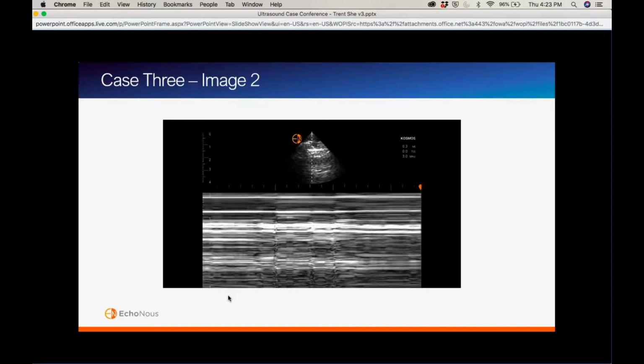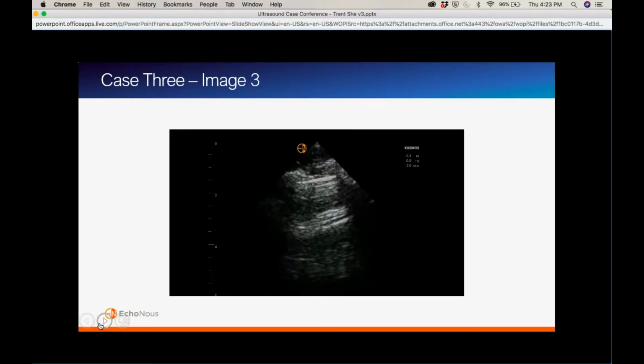So this was definitely something that we were concerned about, that this patient could have a pneumothorax based on this clip. Yeah, and some people find these barcodes a little bit confusing, and sometimes it doesn't help. So you could also just take a clip of the pleural line and see if you see any sliding, which I think you do next. Yep. Looking here, this looks like the most hyperechoic line, which is going to be your pleura. Were you guys thinking that this is sliding?